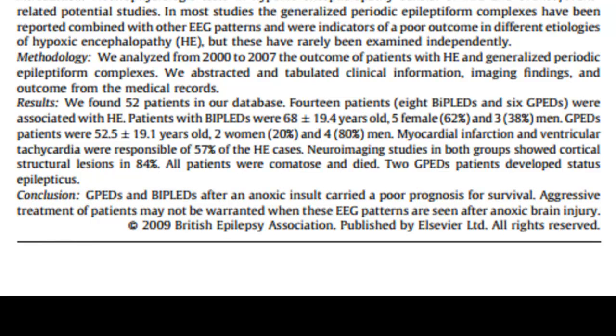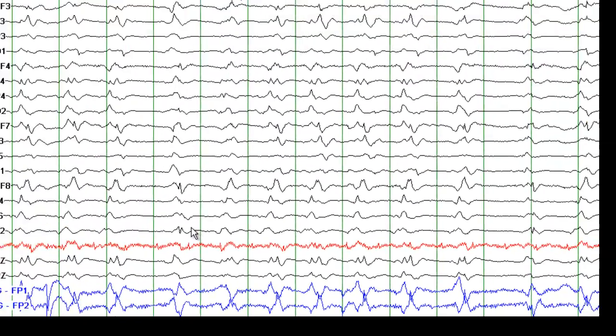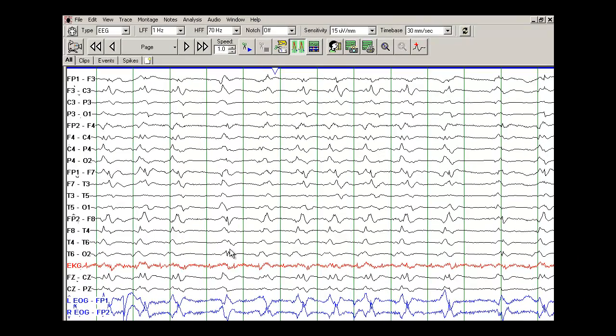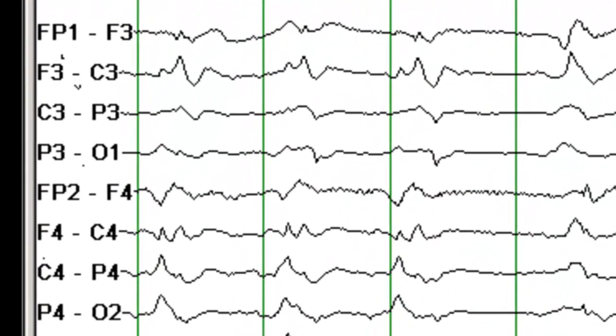So let's go back to the EEG pattern here. So just to summarize, this EEG does not show a normal architecture of the EEG, normal organization of the EEG. It shows periodic discharges on both hemispheres, which are asynchronous. And this pattern is called BIPLEDs or bilateral periodic lateralized epileptiform discharges. When you see BIPLEDs on an EEG, it generally implies a poor prognosis for functional recovery.